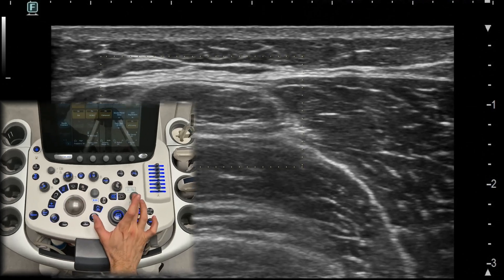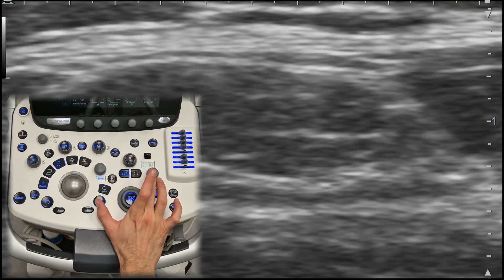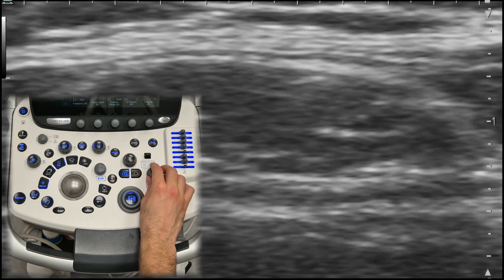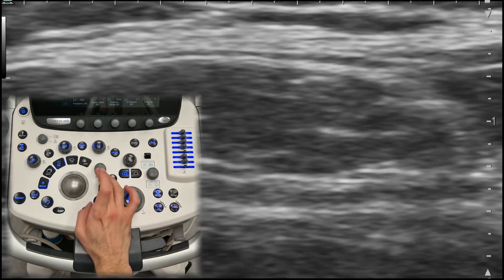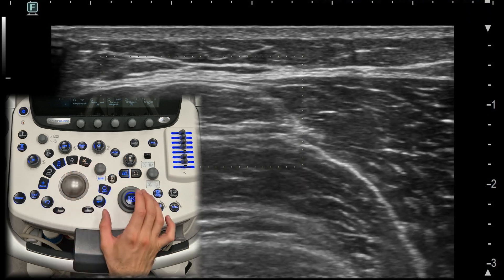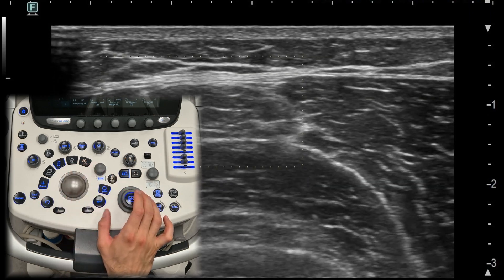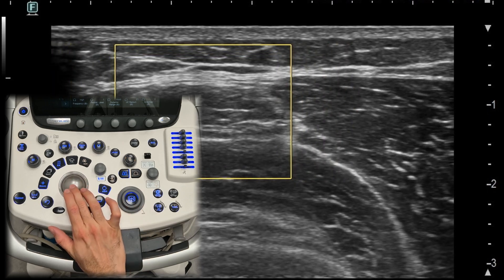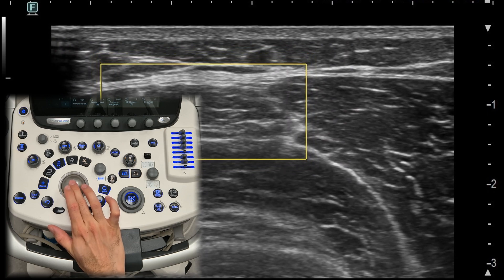The zoom function allows you to enlarge a specific area of interest, making it easier to focus on small or complex structures. However, be mindful that zooming in too much may reduce image quality, so balance the zoom with maintaining clear resolution. You can adjust the zoom area as you like using the trackball.